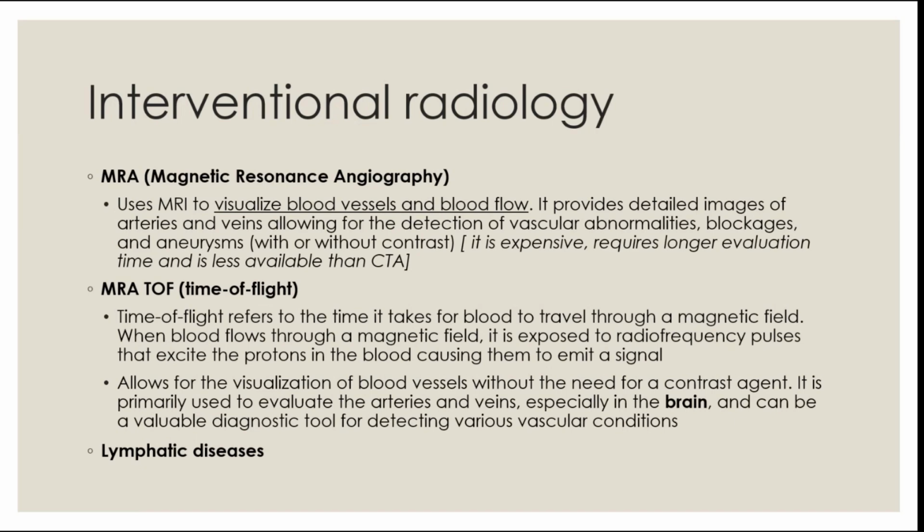And lastly, for interventional radiology, we have MRA, magnetic resonance angiography, just like the CT angio, for visualizing the blood vessels and the blood flow. To detect any vascular abnormalities, any blockage, any aneurysm, you can use it with or without contrast. If it's without contrast, then this is the MRA time of flight, which is the time taken for the blood to travel through the magnetic field.